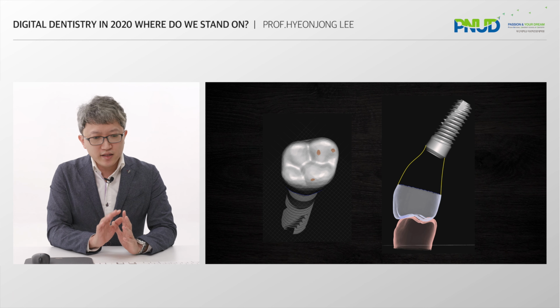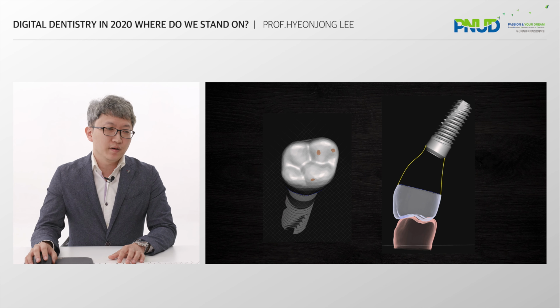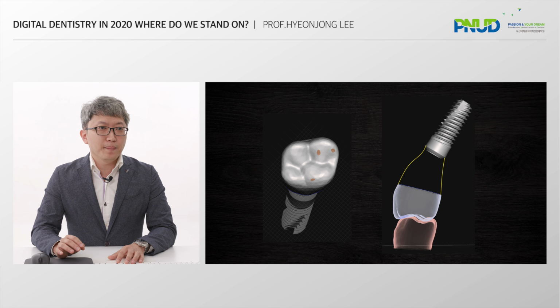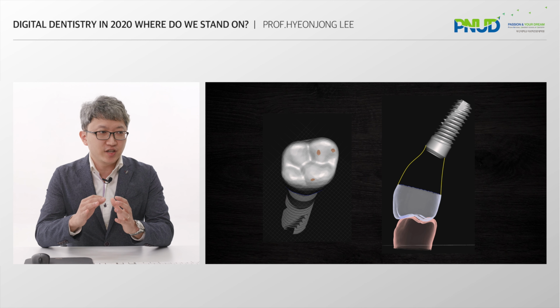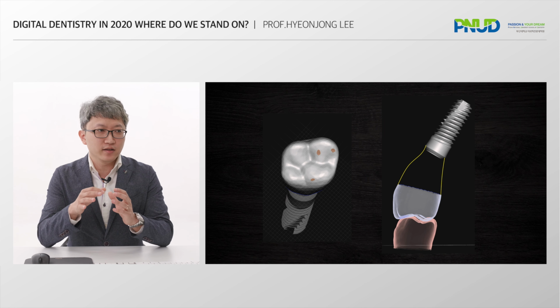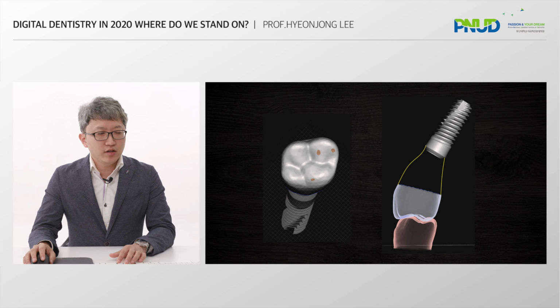So in this process, we need to know the importance of the mean vector and torque of implant stress. If we can analyze before fabricating the implant crown, I think it would be really helpful. So let me show an example.